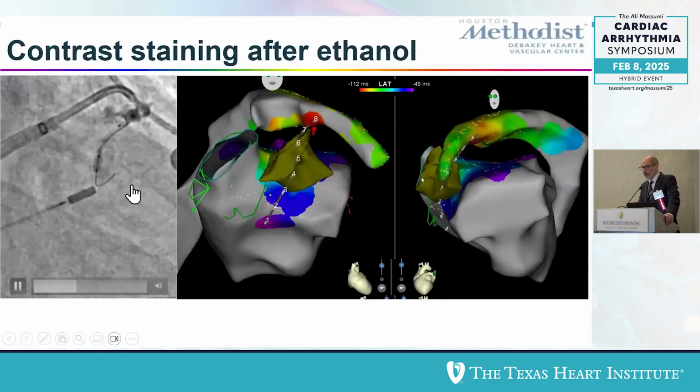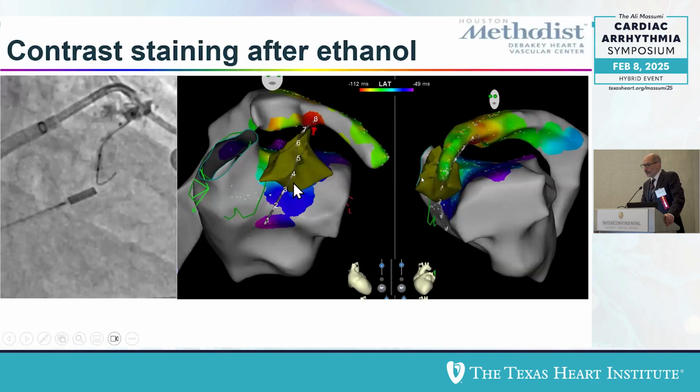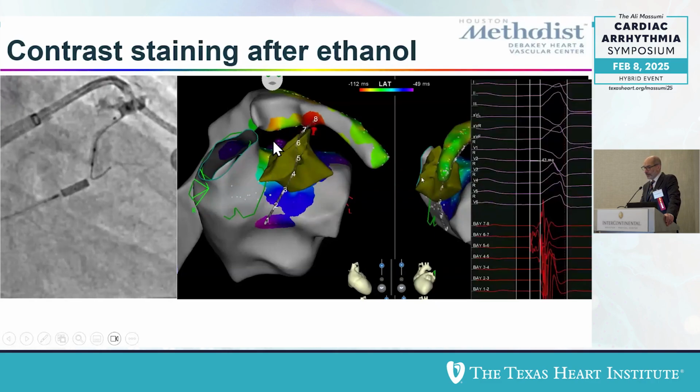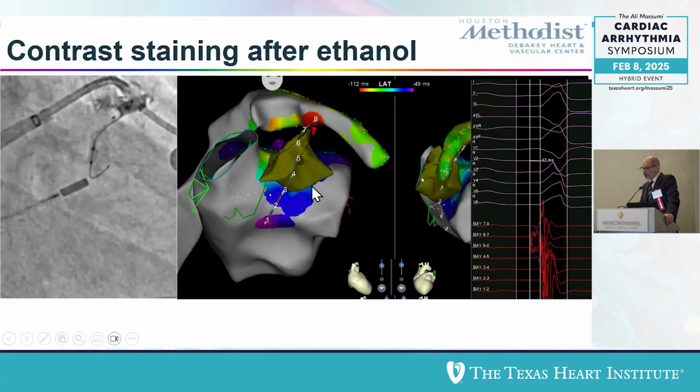This is the way it would look. You get some ugliness, some staining there. You can see the staining on ultrasound, and you can put it as part of the CARTO. You can select the echogenic area. This is the way it looks.